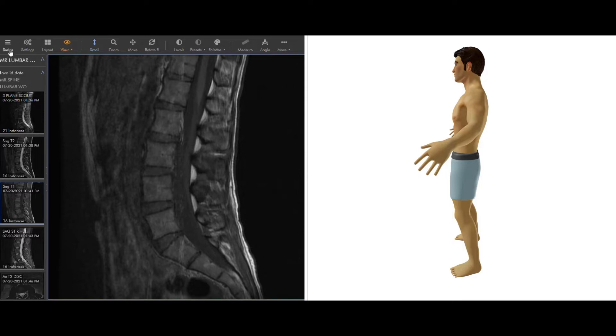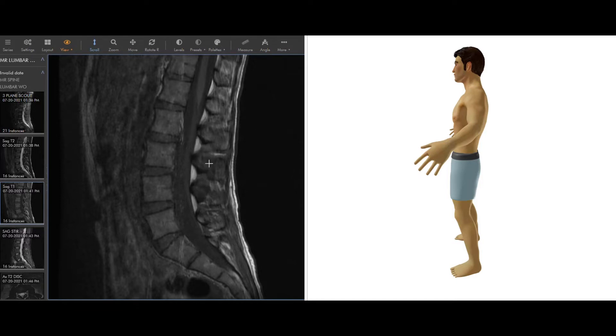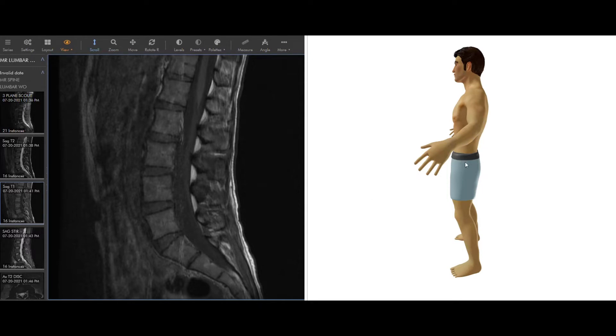This area here, in this box, this would be called an image viewer, so you may hear that term or see that written down somewhere. Anything that shows these files is called an image viewer, and the files themselves are called DICOM files. So all radiology images are called DICOM files, and each image is called a DICOM image. Most disks come with folders of these images. For example, we're looking at the lumbar spine here from the side, so we're looking in this region right here in the lower lumbar spine, and these are vertebral bodies.